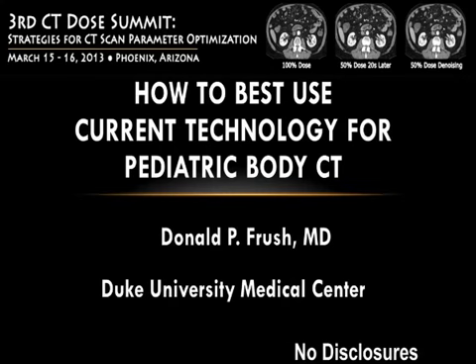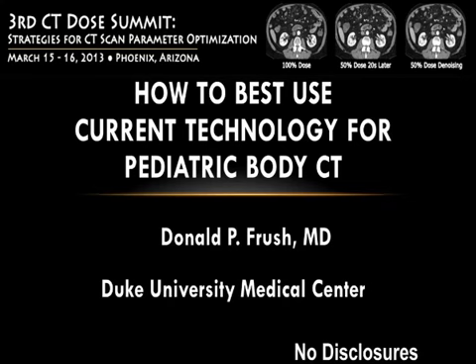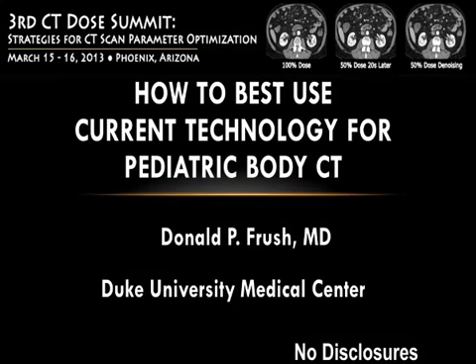Just a couple other issues as I get started. The topic of where you do the axial representation of the patient. I know in Boston it might be different for Dr. Strauss, but in North Carolina, most of our abdomens tend to be the widest dimension rather than the narrowest. In line with that, one of the things we have worked on at Duke, and you'll hear more about the ACR dose index register, is that we provided the ACR with a way off of the topogram to automatically calculate a cross-sectional area, and what we defaulted to in that program was the widest dimension in that scan.